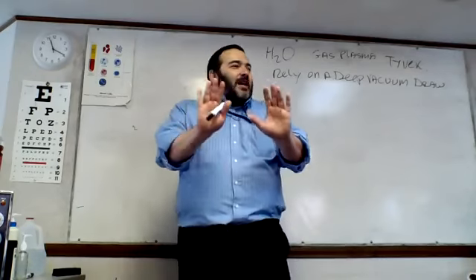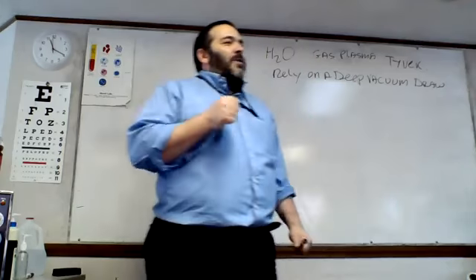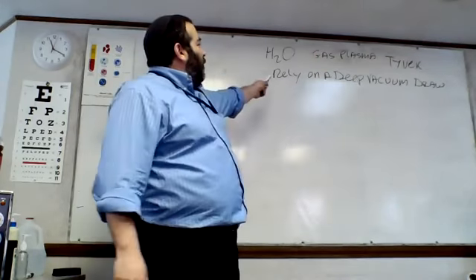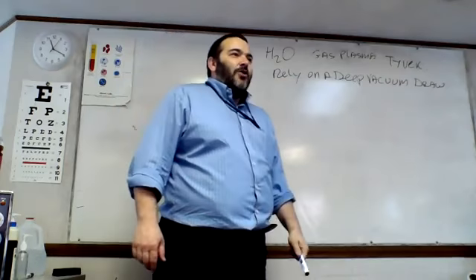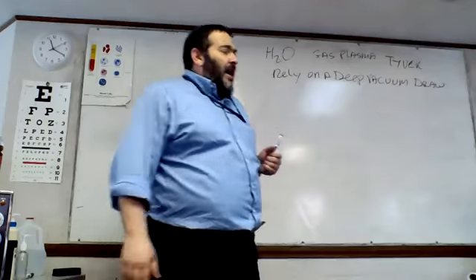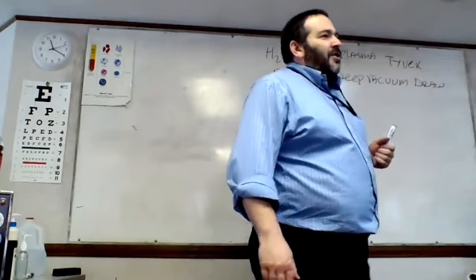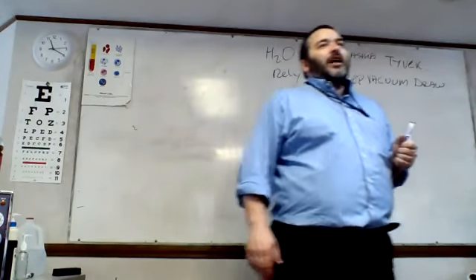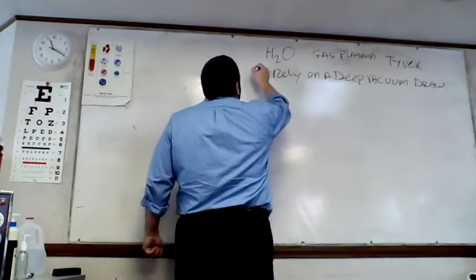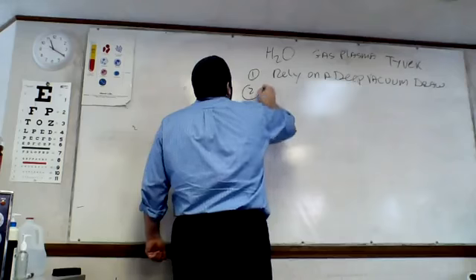We push them into the sterilizer, we close the door, and we begin our preconditioning phase, during which time the sterilizer will develop a deep vacuum draw. Deep vacuum inside the chamber. After that, I will inject my hydrogen peroxide. So, step 1, deep vacuum draw.